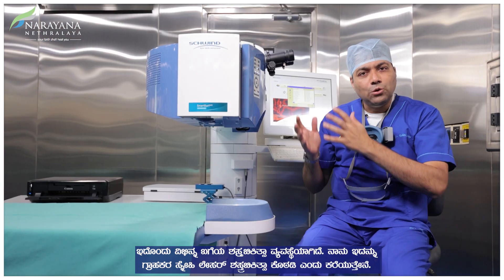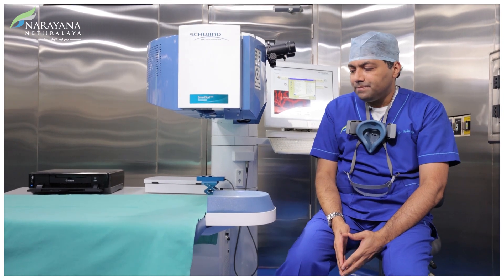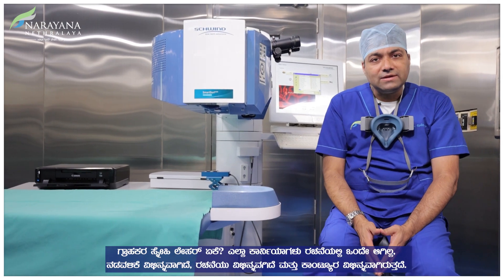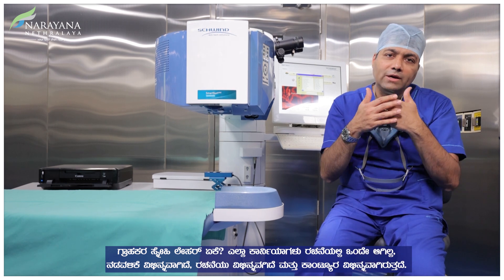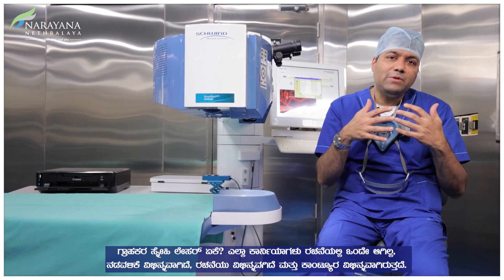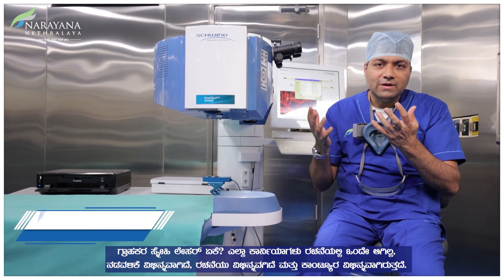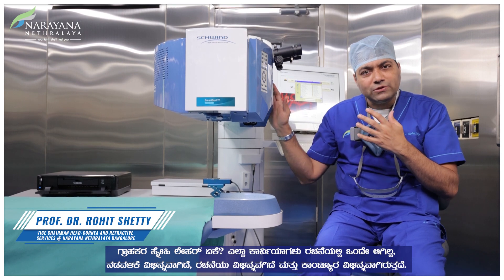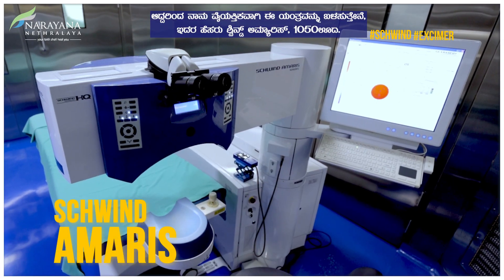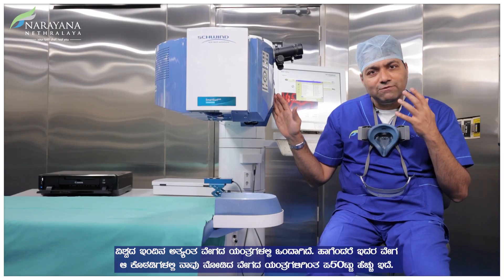This is a different OT setup — I call it the OT for customized lasers. Not all corneas are the same in structure; the behavior is different, the structure is different, the contour is different. So I personally use this machine called Schwind Amaris 1050 Hz, one of the fastest machines in the world today — 50 times faster than the fastest machines we saw in the other rooms.